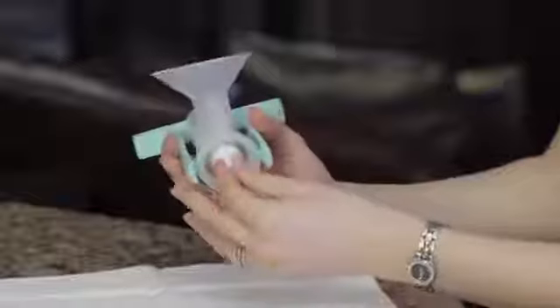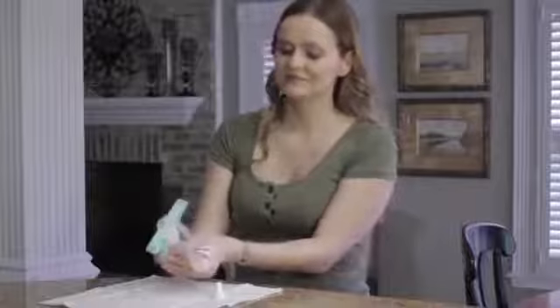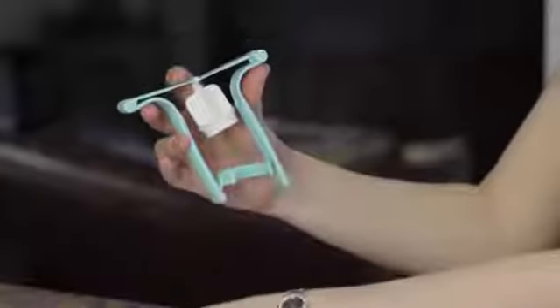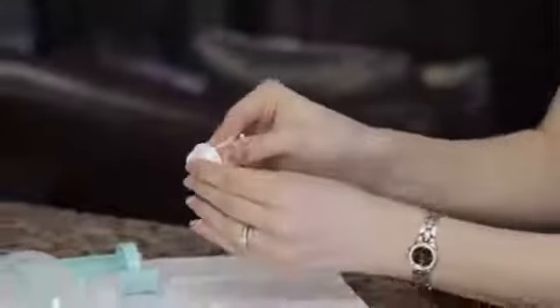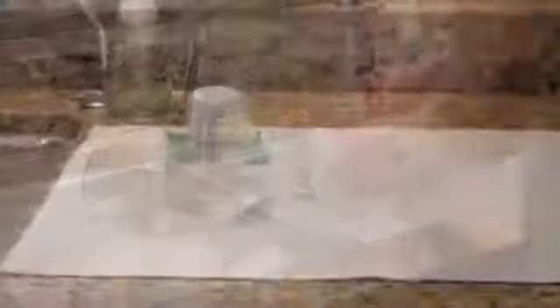To clean the one-hand breast pump, take it completely apart. First, remove the white valve carefully by pulling it off by its thick sides, not the flat edge. Next, detach the handle from the breast flange. Then gently pull the piston out of the upper chamber of the flange. Flex the center of the handle and the piston will detach easily. Finally, remove the piston seal. Rinse all parts in cool water, then wash them in warm soapy water, rinse them well, and let them air dry.